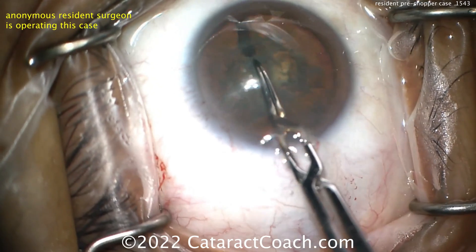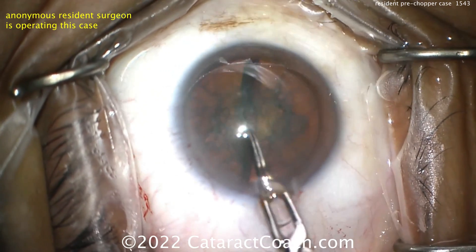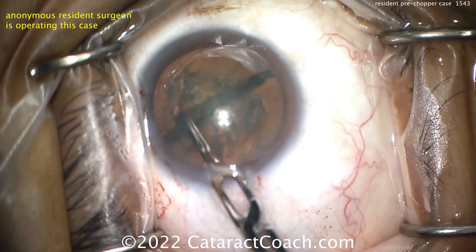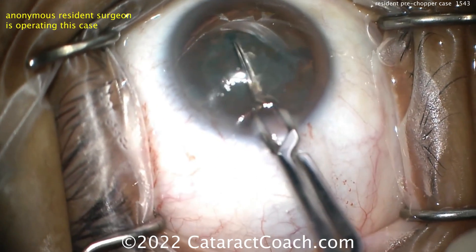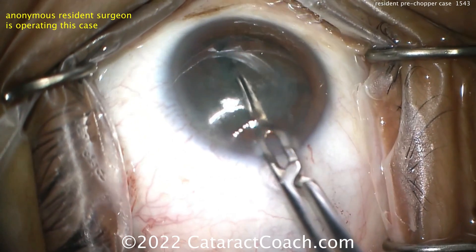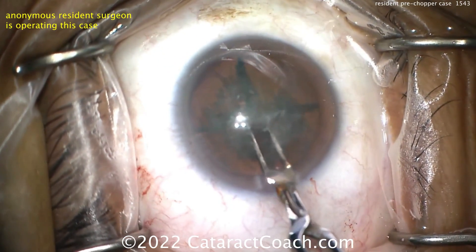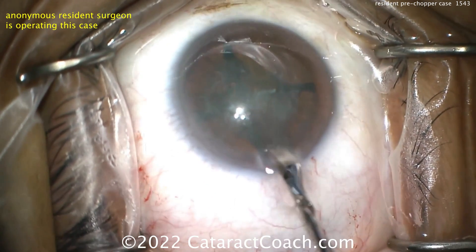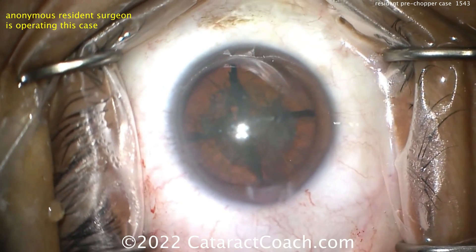You place the pre-chopper into the nucleus and spread it apart, and it'll split the nucleus. That's a really nice technique if you're having trouble with phaco chop or don't like divide-and-conquer. Now using the same instrument to rotate the nucleus and split it again. Getting the eye back in primary — much better. Splitting again: now you've got four nice-looking quadrants.